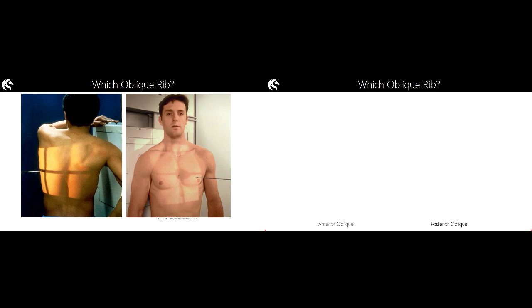You will encounter radiographers who believe that the best way to image a patient for ribs is to magnify the ribs as much as possible. I don't see any advantage in this. Sure, the structure is bigger, but it's not as sharp, and so if you have got a small hairline fracture, you're not going to see it as well.